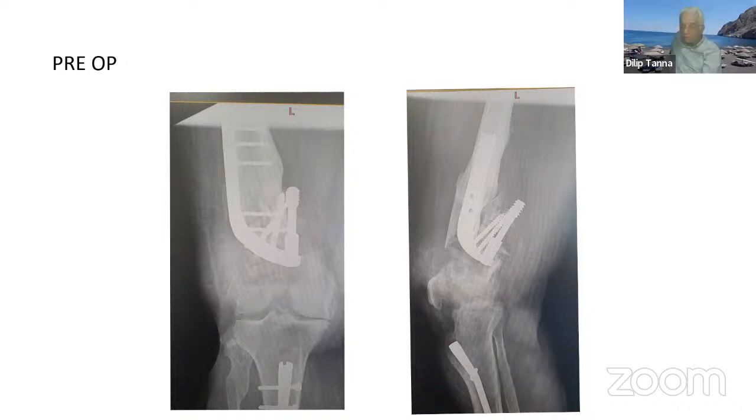Yeah, see, I think before you people joined, I showed two distal tibias, oblique fracture, where after the nail and after the fibula plating also, some movement was demonstrated. So I put in an accessory plate onto it. Even with these 3 screws, with that oblique fracture in the lower 1/3, it wasn't stable enough. That's the reason I put in the plate and the patient could walk about immediately. And the fracture is slowly healing up.